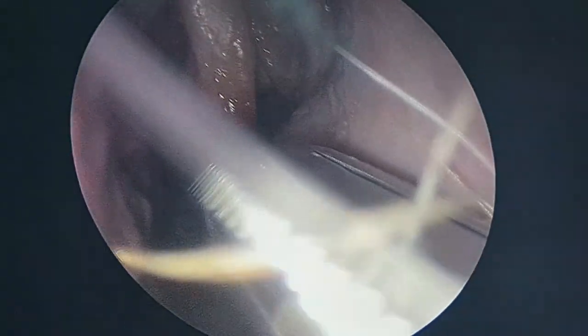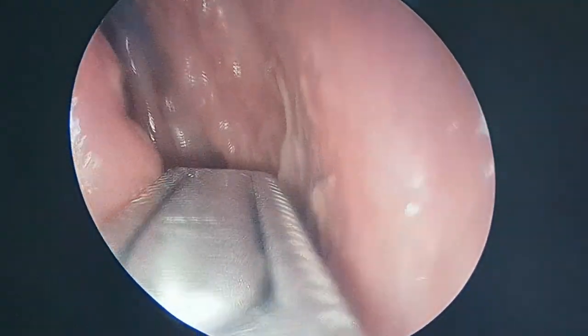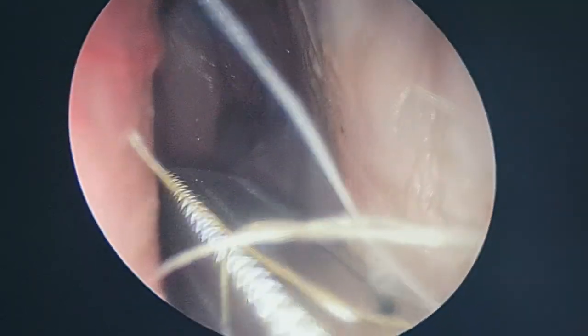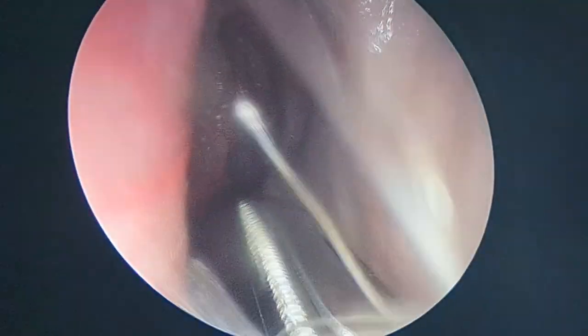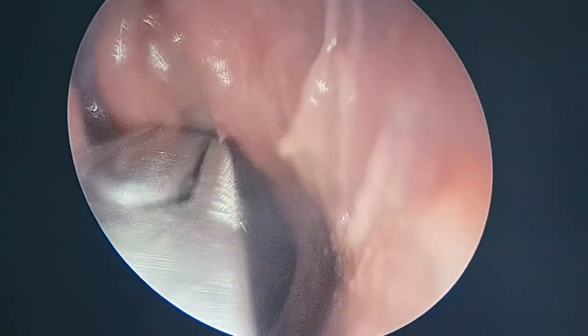At the opening of the nose, follow with the endoscope, instrument and endoscope together. When you bring them out, bring them together so as not to give any trauma to either of the walls in the nasal cavity. Always inside, outside, under endoscopic navigation, under endoscopic guidance, number one.